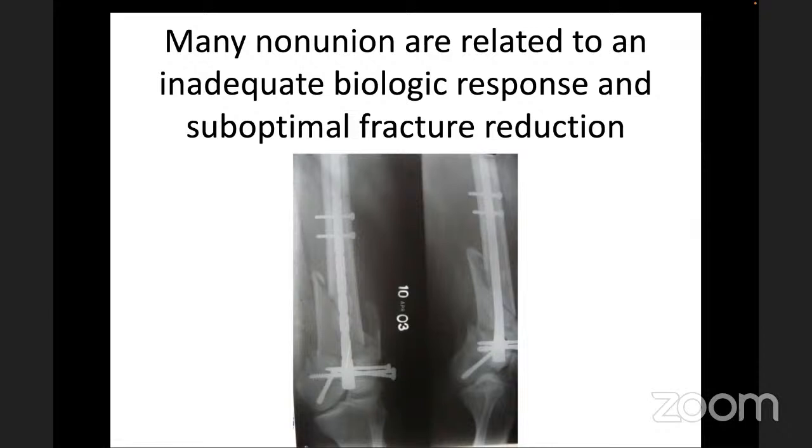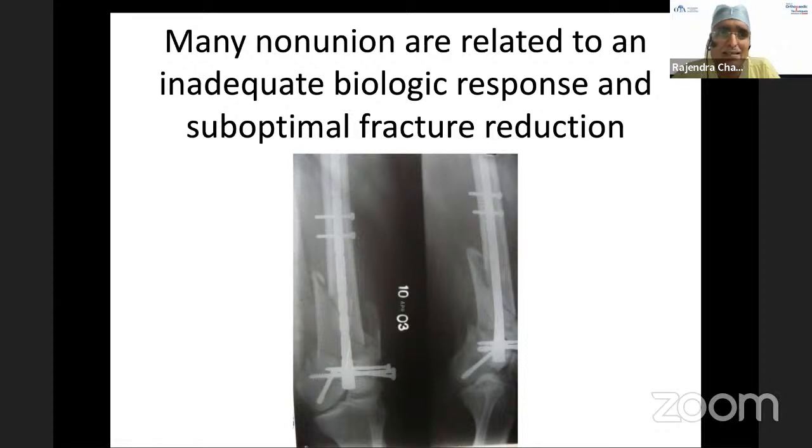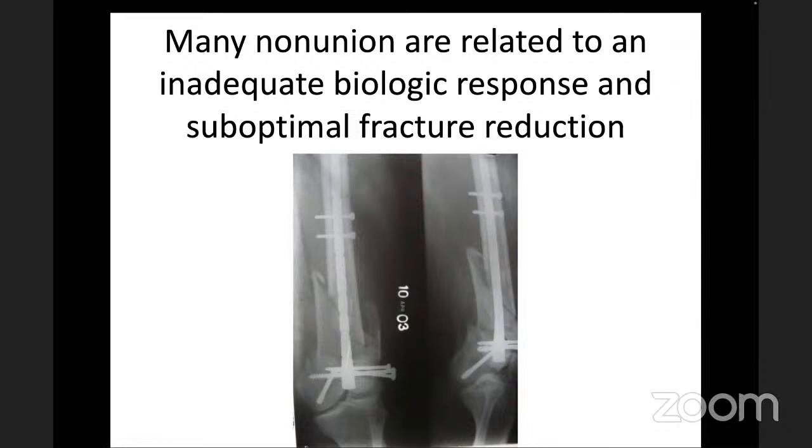Sir, why should there be an indication of nailing in such an intra-articular fracture with metaphyseal extension? This patient came to me, sir. No, we are discussing the subject. So I don't think there is any indication of nailing in this type of case where there is already a coronal split in the condyle. Anything you do, there will be separation unless you open it and assemble the fragments. So the heading is suboptimal fracture reduction and fixation modality. With that, the choice of implant is also wrong, I think. Yes, I totally agree. I think nothing is right here.